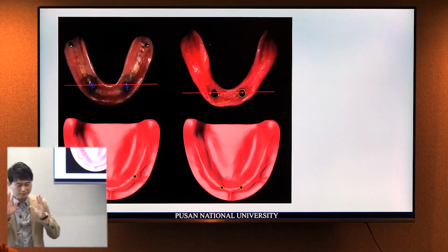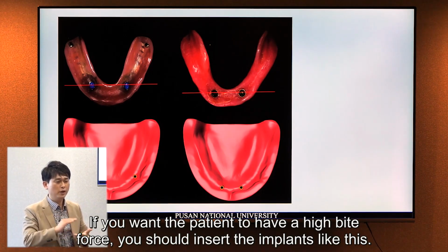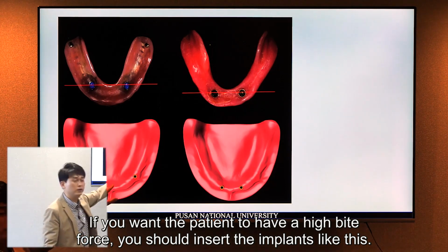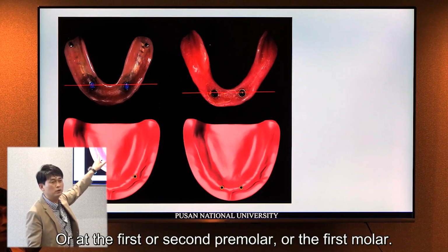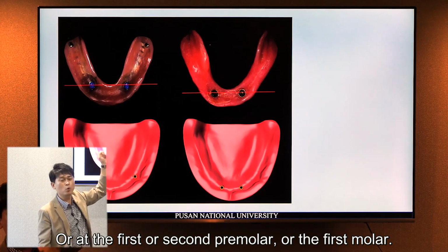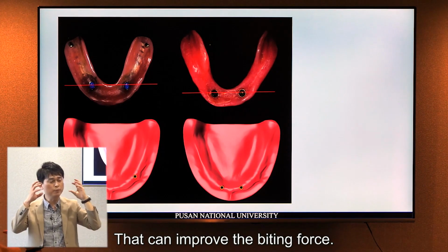So if you want the patient to have high biting force, you have to place the implants at the first or second premolar, or number 6, or the first molar area. That can improve the biting force.